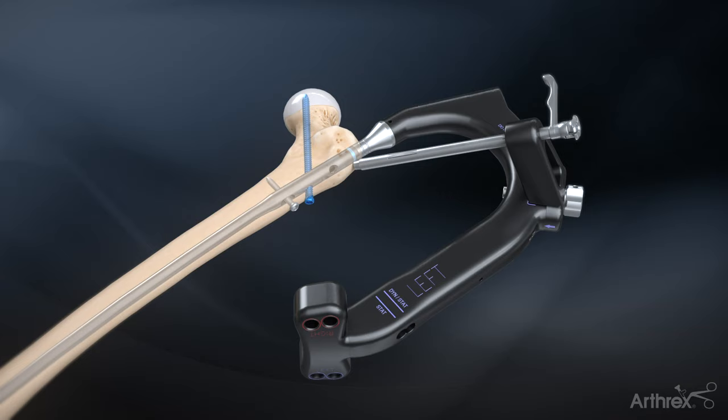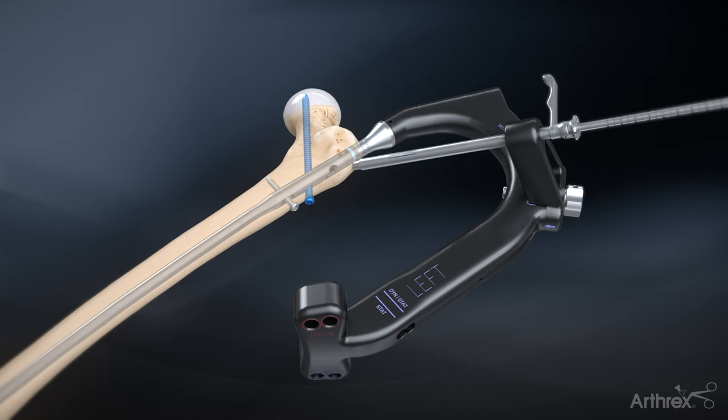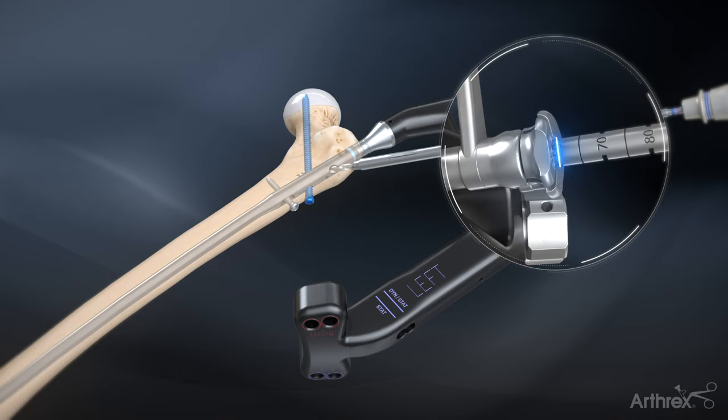Slide the screw sheath, 5.5 mm drill and obturator assembly through the proximal hole in the targeting guide. Drill to the appropriate depth using the calibration marks on the drill.